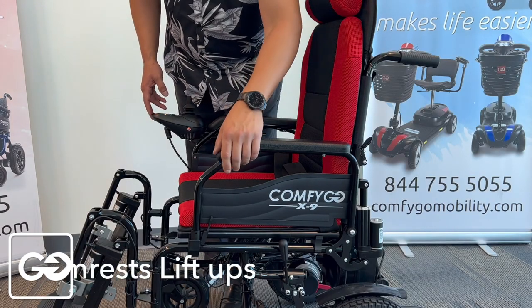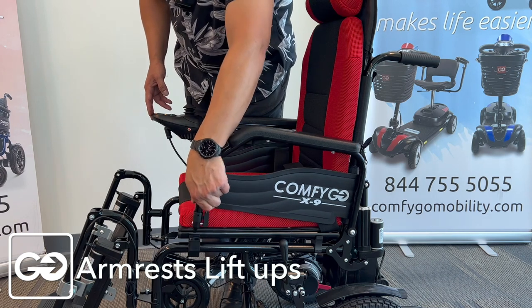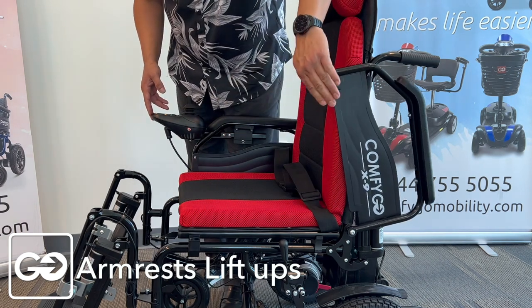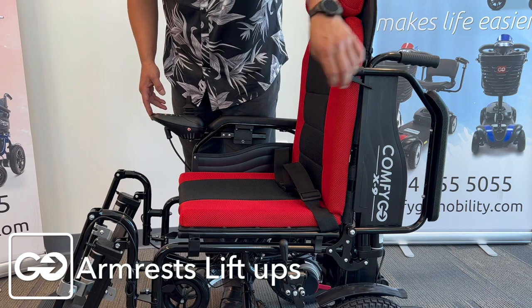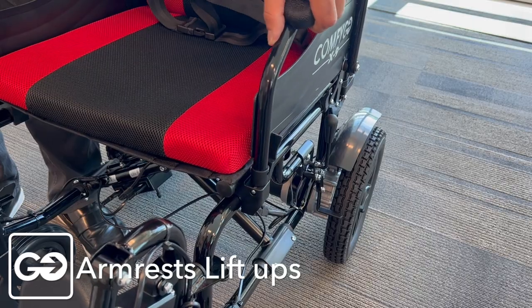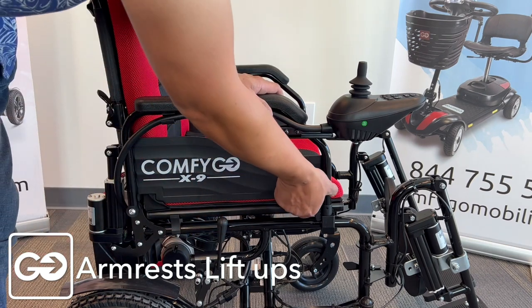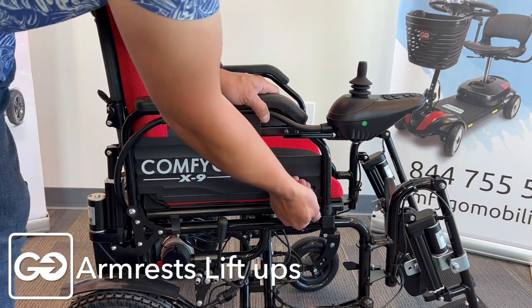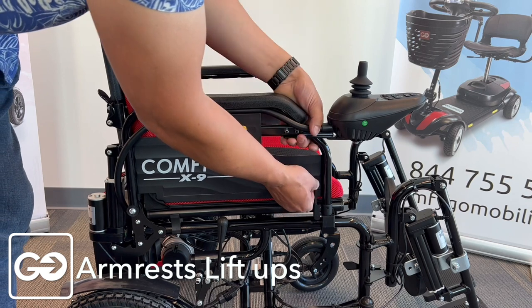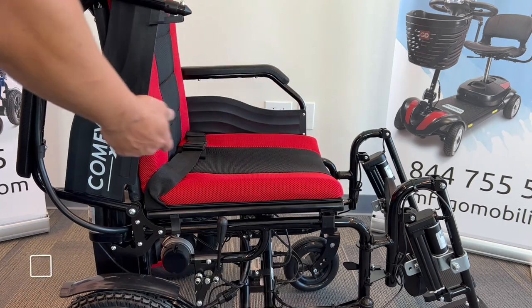One more thing to mention about this chair: we do have a lifting system on the armrest. If we press this tab and pull this up, we can have the arm raise up for easy access on the left side. Just push this down and it will latch into place. Lifting the right side armrest is very simple as well — press this button here and it releases the pin. Pull this up and lift that armrest away, allowing for easy access in and out of the chair.